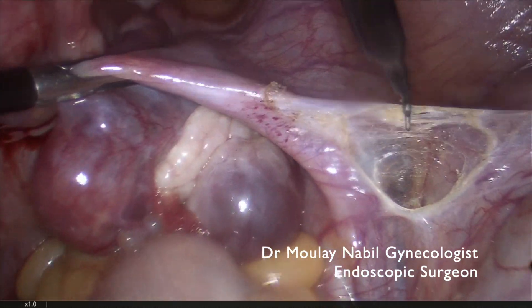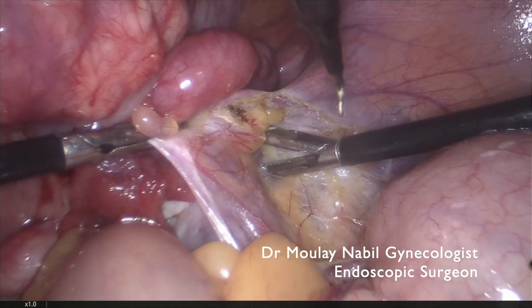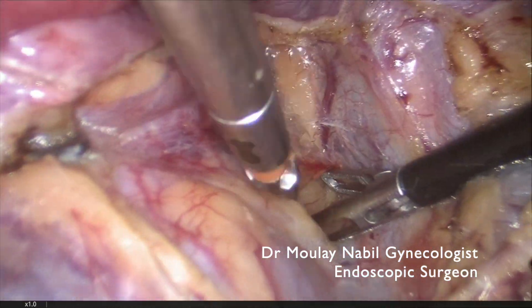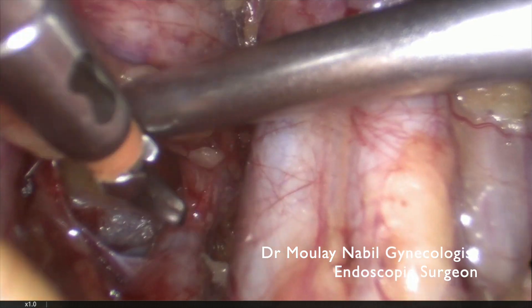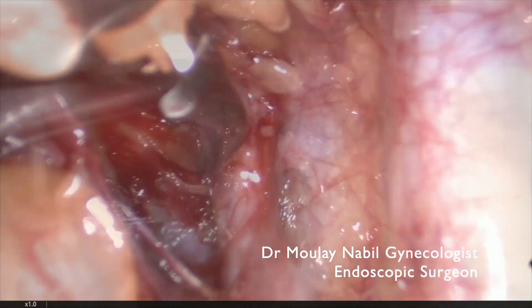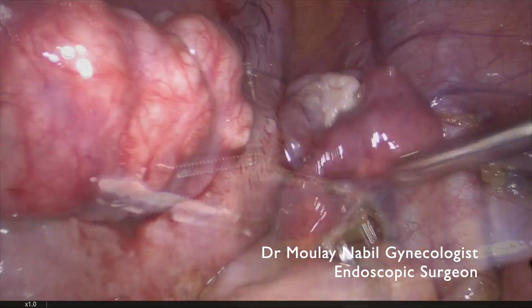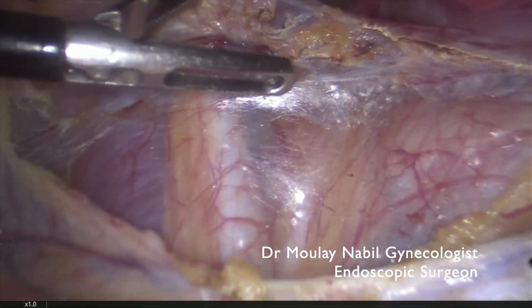The next step is to perform transitory vascular control. We use bilateral control of the internal iliac artery at their origin. For that we open the retroperitoneal space to localize the ureter and dissect the internal iliac artery, which is clearly seen. We place the bulldog clamp on the internal iliac artery, then perform the same step on the left side by opening the peritoneum.